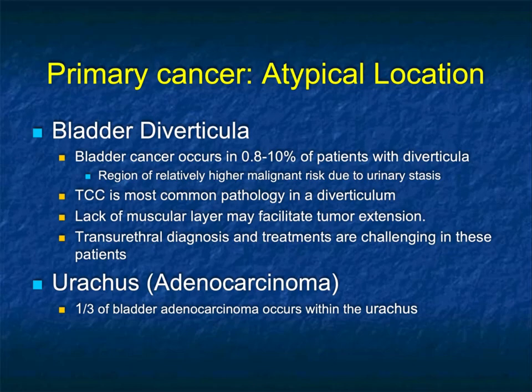I also make the point that we do see bladder diverticula in up to 10% of cases. You want to look carefully at bladder diverticula. Sometimes they don't empty well and can cause the patient to have symptoms related to that or be a source for infection. But you can get TCCs within a diverticulum.